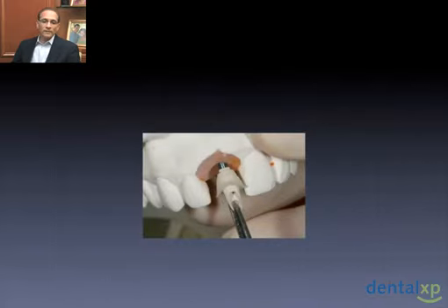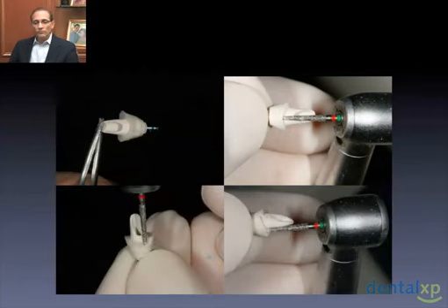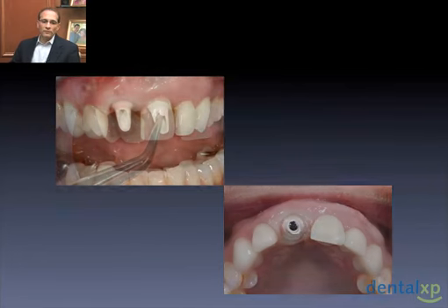And what we'll do now that we have the abutment again, we're going to start to refine it and finalize our margin, finalize our subgingival contour so it has the emergence that I'd like, and make sure it's just where I want it to be. Bring it back to the mouth and try it in. Now, what you'd see here is the difference between where I lasered and where the benchtop model soft tissue contour was. And we go to place this provisional abutment in, and you're going to see that we're going to get some blanching, but kind of splitting the difference. If I had lasered the tissue all the way, then I may not get the support I need, whereas if I went ahead and used the subgingival contours and the provisional abutment to help push and guide the tissue, it'll bring me the final contours I need.